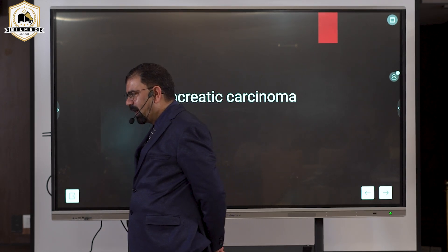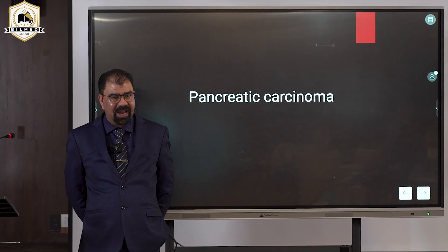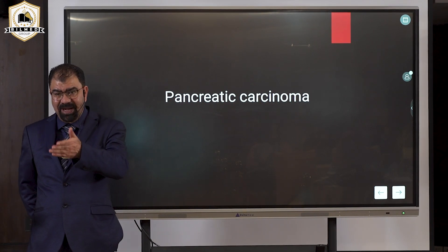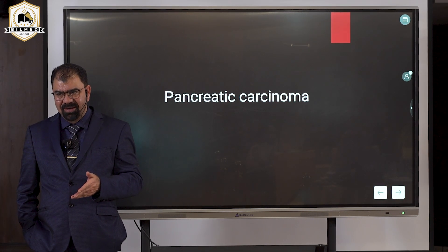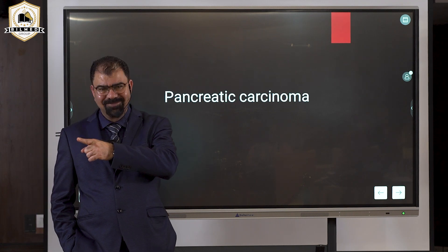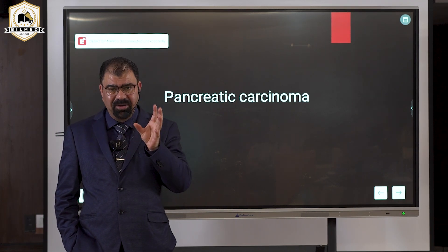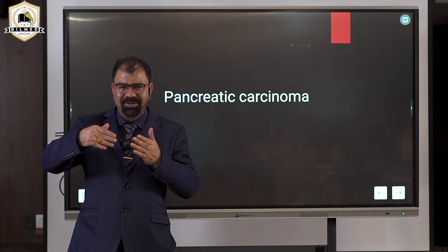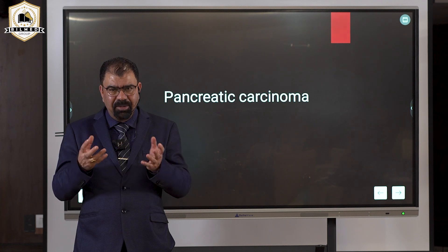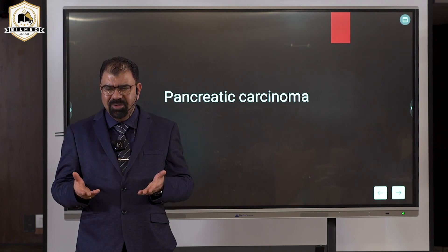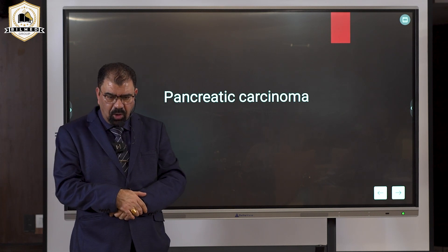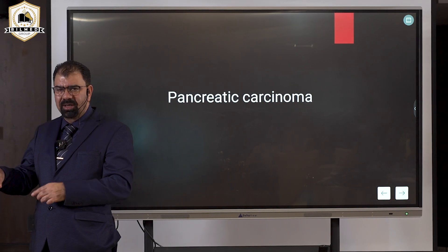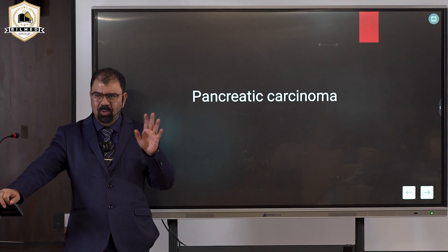Whenever you see a hypoechoic area, that is more worrisome than a hyperechoic area anywhere in the body. If there is dead tissue, that means calcification. Calcification goes against malignancy — because malignancy means rapidly multiplying cells, while calcification means a bunch of dead cells. They are contradicting each other. So if I see a calcified focus, that goes in favor of benign, not malignant.